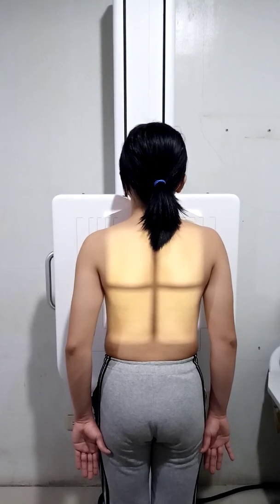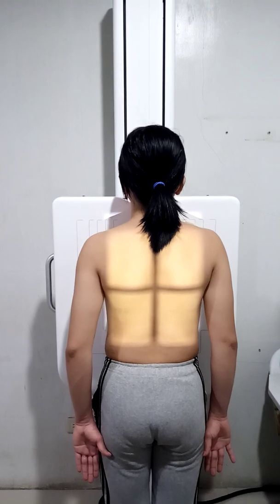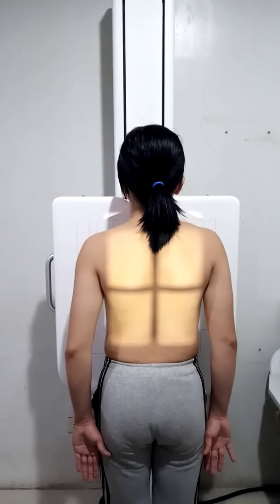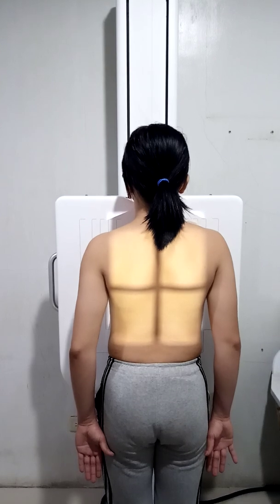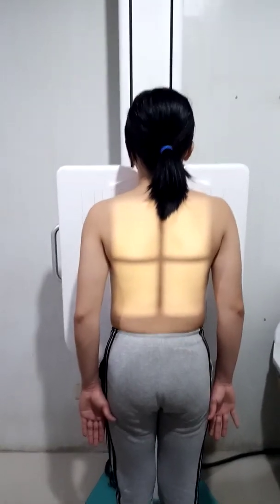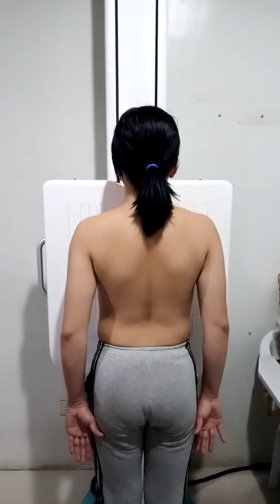Then in the evaluation criteria of the PA ribs, if you expose the patient above the diaphragm, the ribs 1 to 10 should be visualized, and below the diaphragm, ribs 10 to 12 must be visualized.